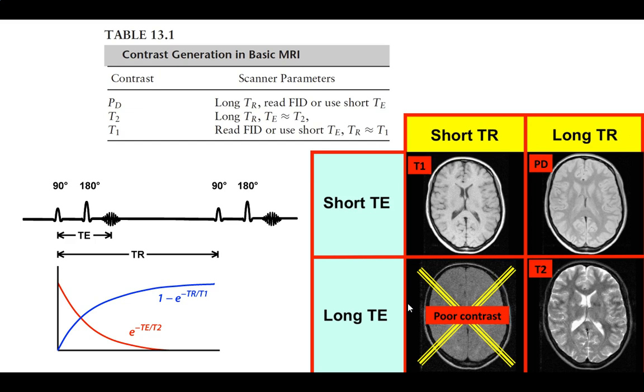When we come down to T2 weighting, everything is now governed by TE. All right? And so we'll need TR to be really disgustingly long because we just want everything to go back flat and start it all over again. Remember this one, I don't want to start it all over. I need that kind of double shot. This one I need clear between everything. I need a fairly long TE because I have to get a contrast set up. And I'll show you why that works.